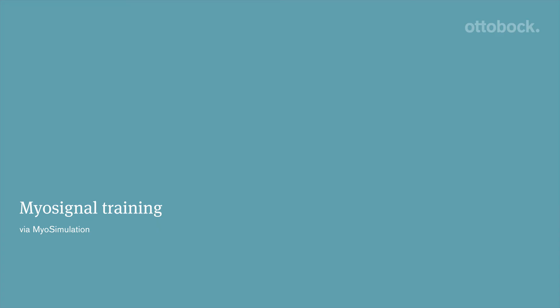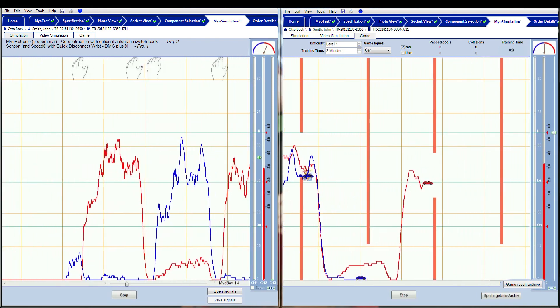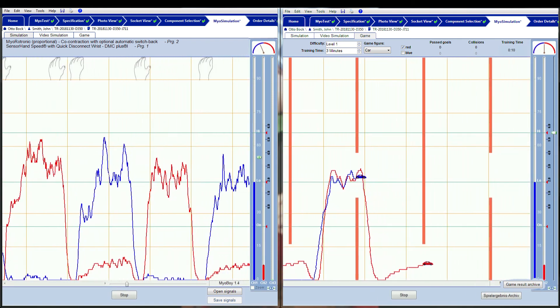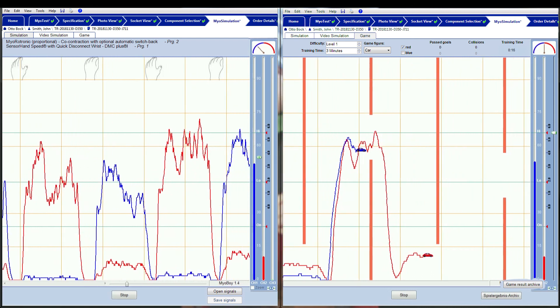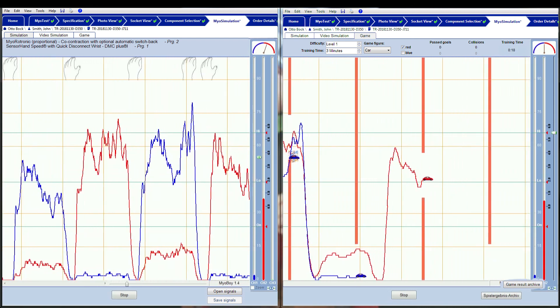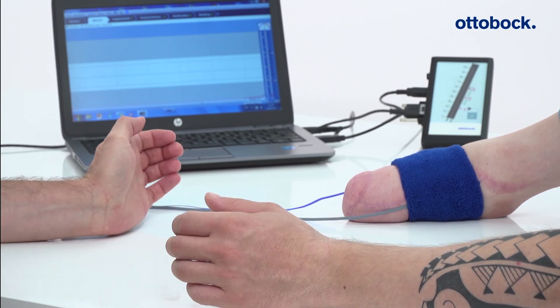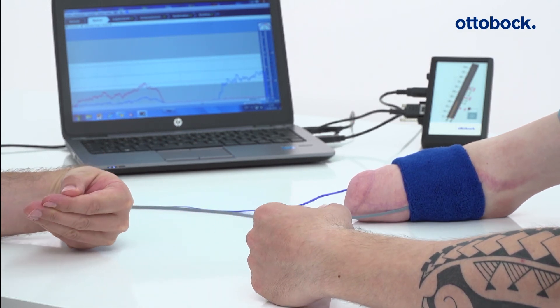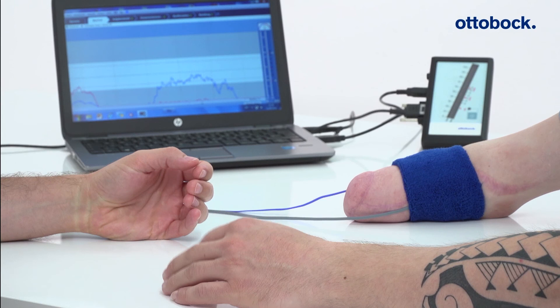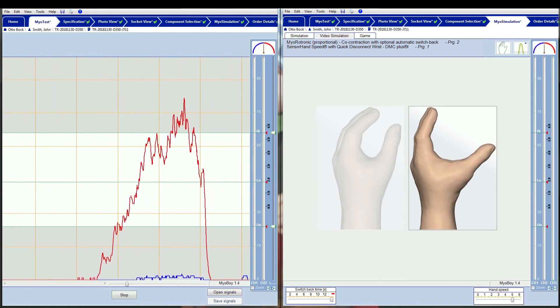Once both myosignals have been evaluated and the switching method is defined, check and train the settings with the myosimulation in Paula software. This ensures that the user can control the prosthesis independently and reliably in everyday life with the selected adjustments. For optimal training effect, instruct the user to perform individual prosthetic movements, for example: open hand, close hand, co-contraction, pronation, and supination. To check the reliability of the movements, vary the speed and the order.